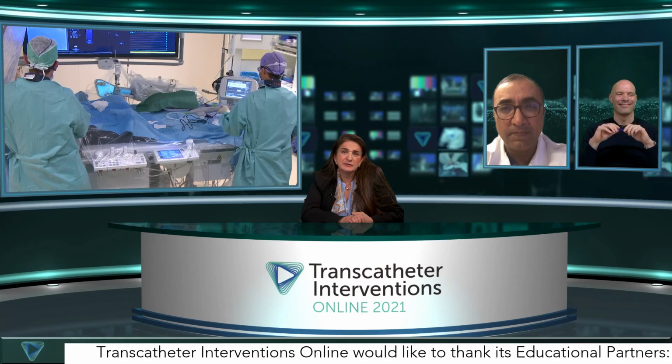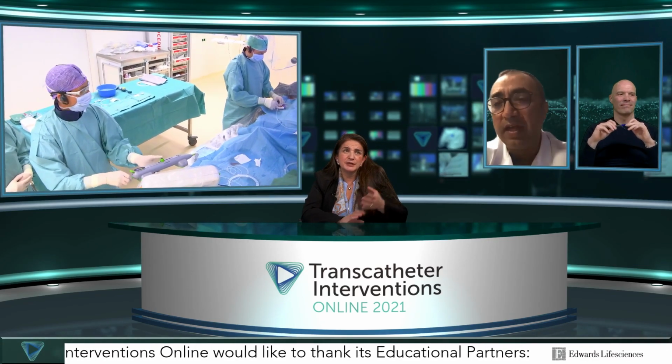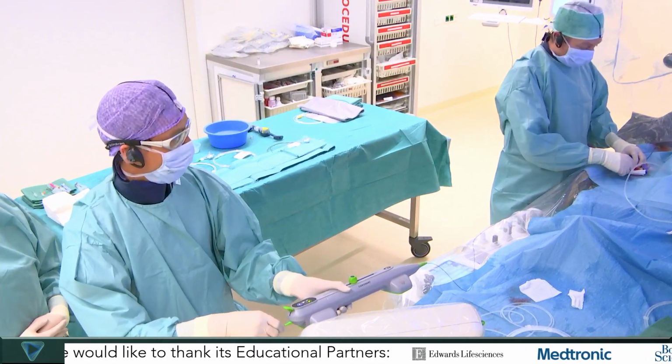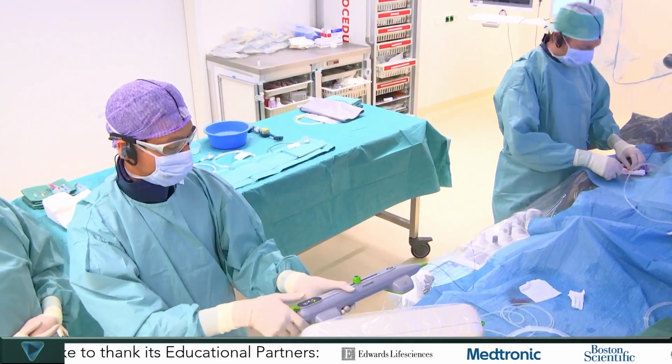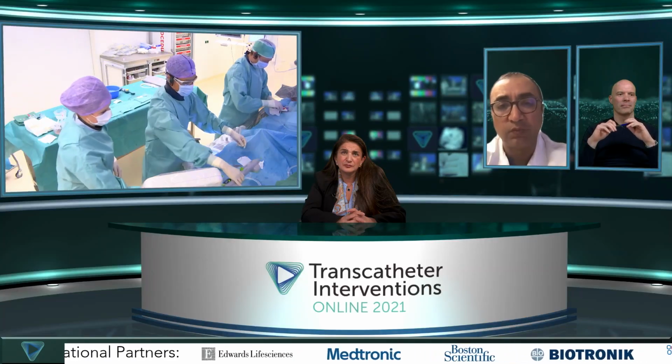Oh, really, really nice. The only thing different we might have done, you can see, is be more comfortable coming out. Yeah, so it's quite controlled. Based on what Roxana said, we might have gone with the highest speed proximal. Just one run at the end.